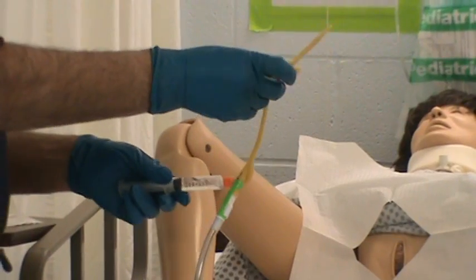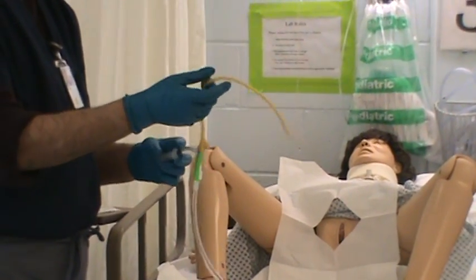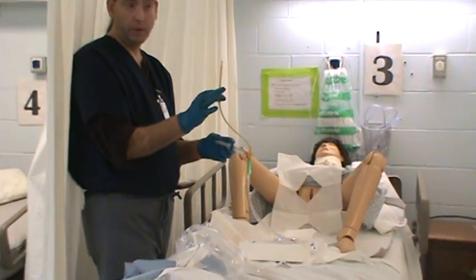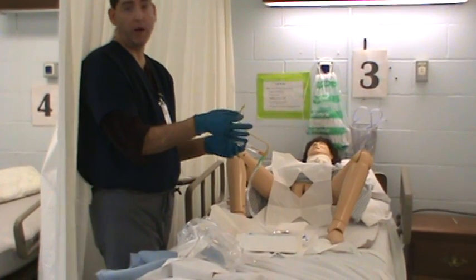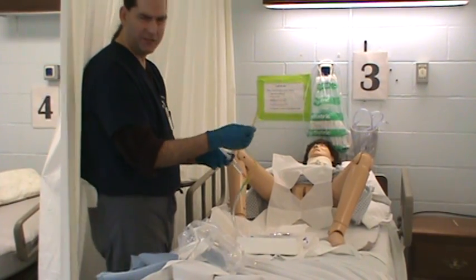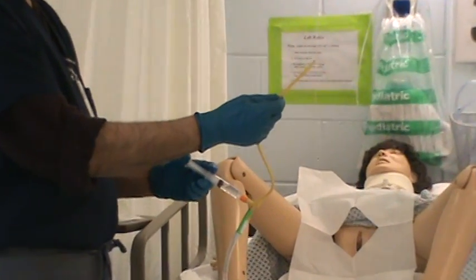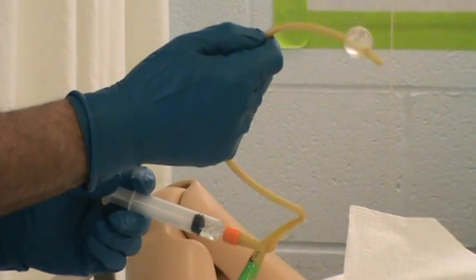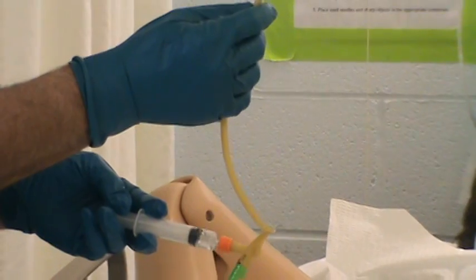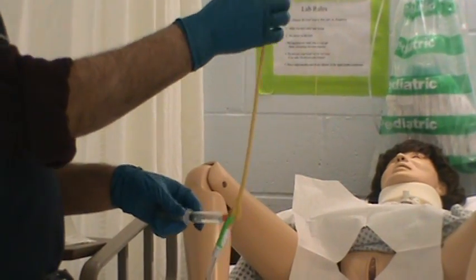If you do drop something or mess something up on your catheter, you can say, 'That touched the bed, I'm going to have to get a new kit.' And you would — that's what you've got to do. But always be cognizant that you just burnt a couple hundred bucks of the patient's money because you messed up, so always try to be as careful as you can. If you make a mistake, just say it was wrong and you can't do it that way. Everybody makes mistakes — just don't continue on and give them a big raging infection that could kill them or damage their kidneys.